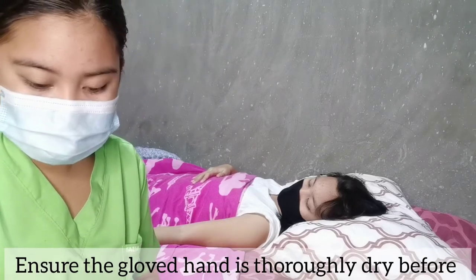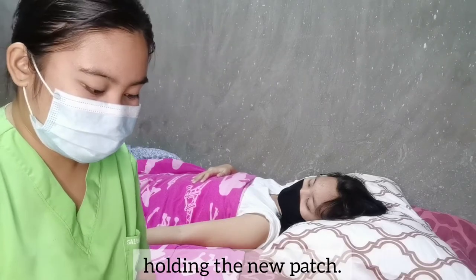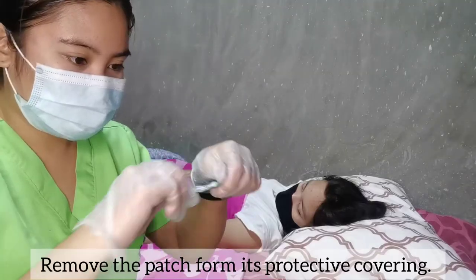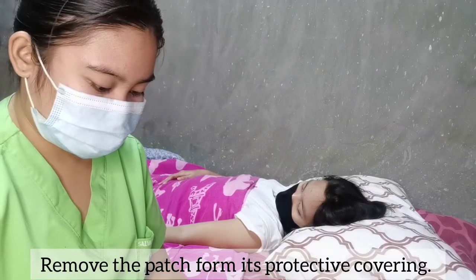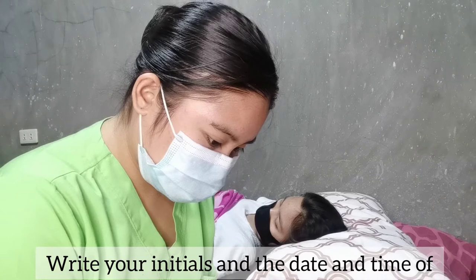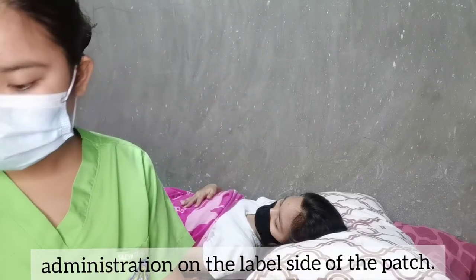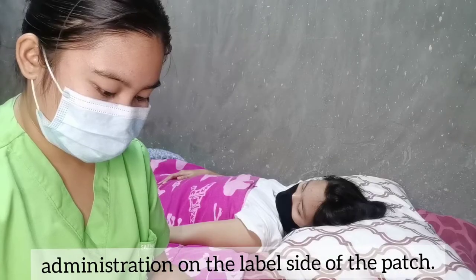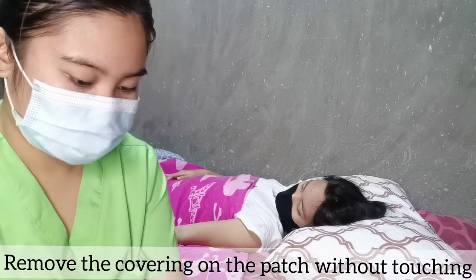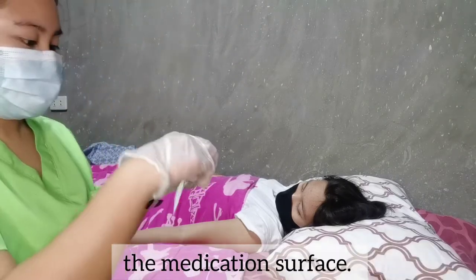Ensure the gloved hand is thoroughly dry before holding the new patch. Remove the patch from its protective covering. Write your initials and the date and time of administration on the label side of the patch. Remove the covering on the patch without touching the medication surface.